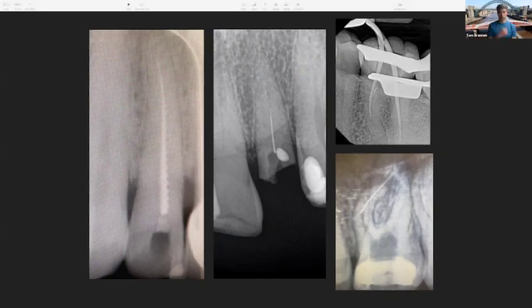The one on the top right on my screen, look at it again. It's just cyclic fatigue. It's a small part of a K file that's probably been overworked in some of the other teeth, and it's just bound a little bit, and that's the final thing that as they've pulled it, it's come away. So again, we know that one should come out relatively easily. It just involves sort of loosening up a little bit around the top.